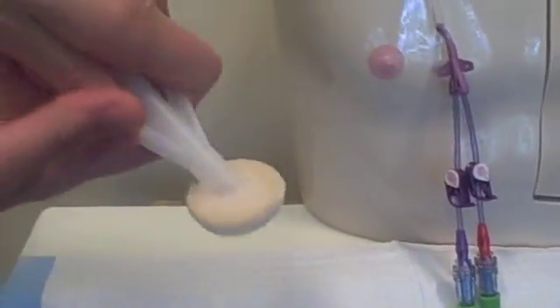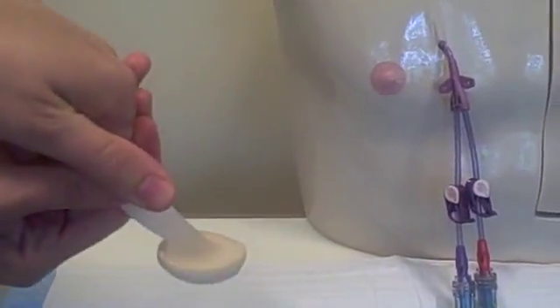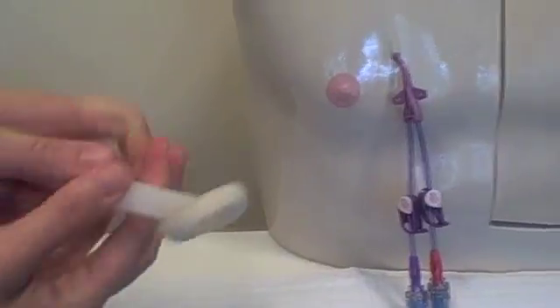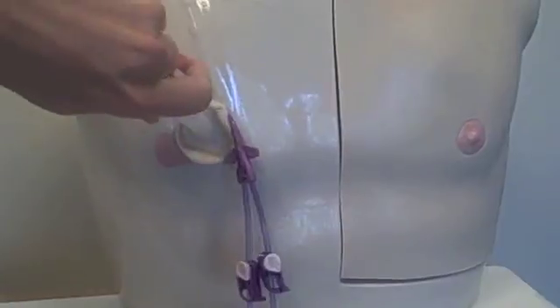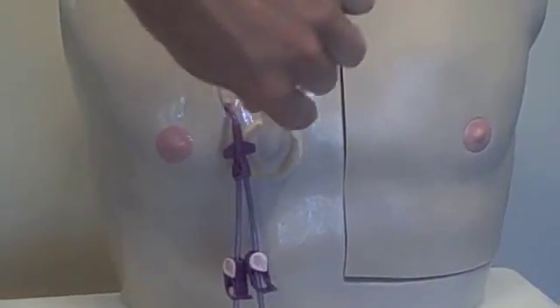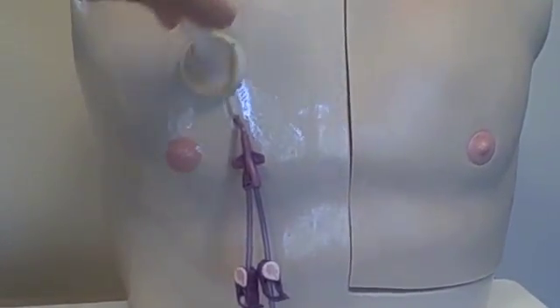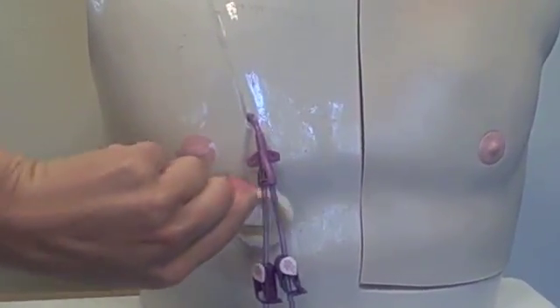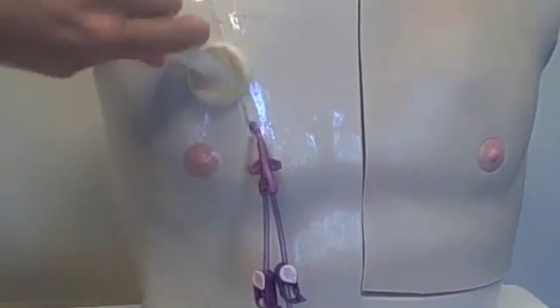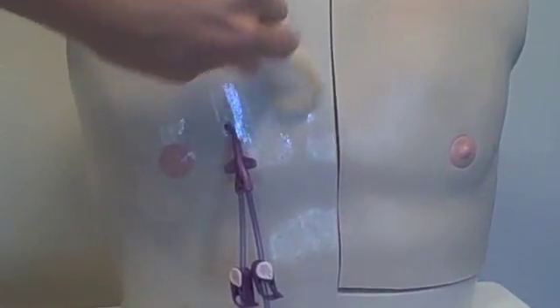Next, you will use the chloroprep swab. In order to use, squeeze the wings together to release the chlorohexidine into the sponge. Use the chloroprep swab to clean around the insertion site, moving both back and forth and in a circular motion at the same time. Clean in an outward and back and forth motion for 30 seconds. Allow the area to dry. While drying, do not blow on or fan the area. Drying may take 1 to 3 minutes.